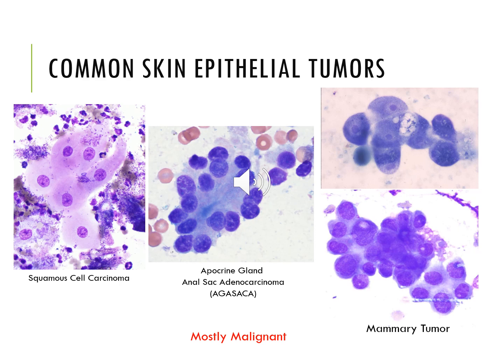So here, there's very little criteria of malignancy. There's very mild anisocytosis and anisokaryosis. You have this cluster of epithelial cells, and then you have a few bare nuclei over in the upper right-hand corner. But overall, it doesn't look very bad.